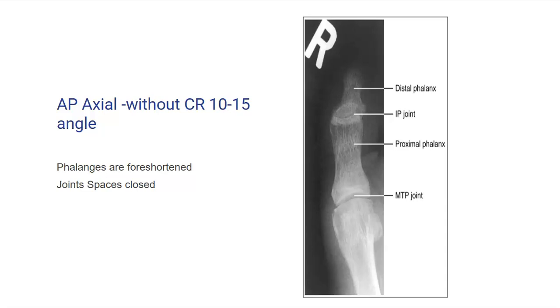It's critical that we employ proper positioning and central ray techniques so that we are ensuring we're producing quality imaging.